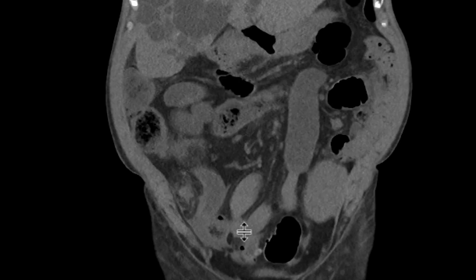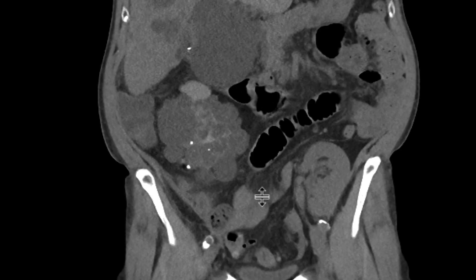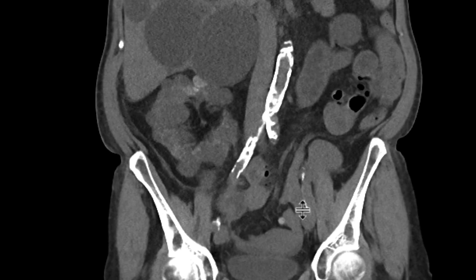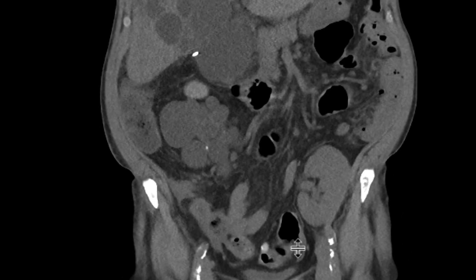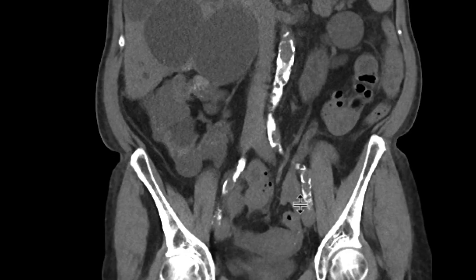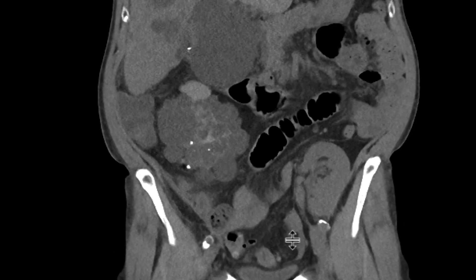As we scroll through and as it goes upwards, again thick-walled inflammatory change. And going upwards, that appendicolith, that blind-ending tubular structure, thickened wall with inflammatory changes associated with this, and some free fluid as well. And so these findings are compatible with acute appendicitis.